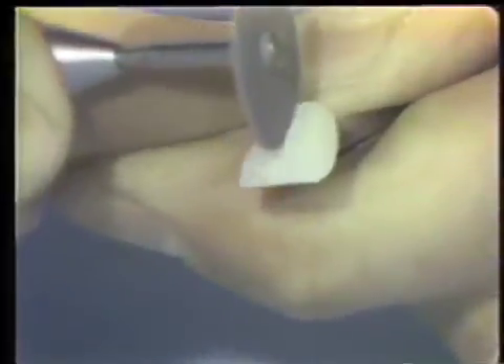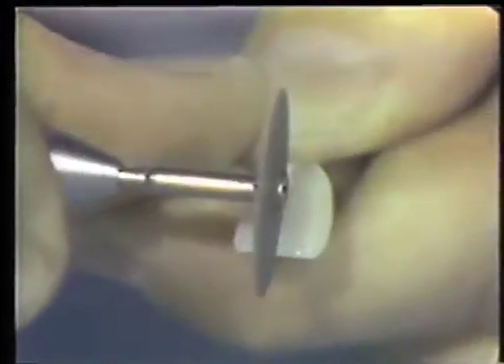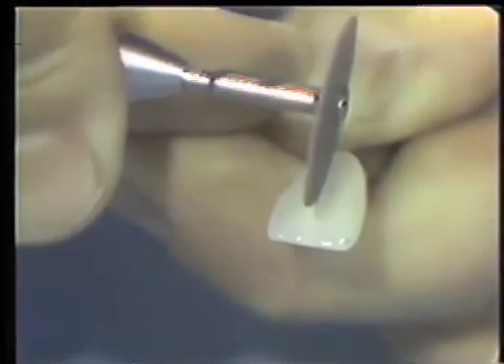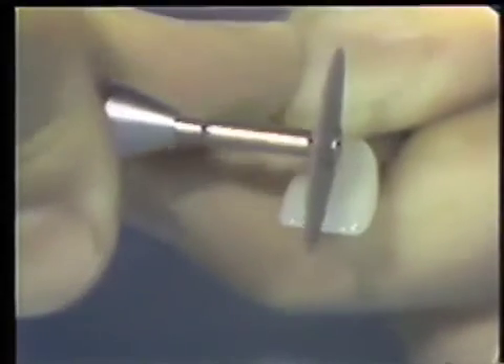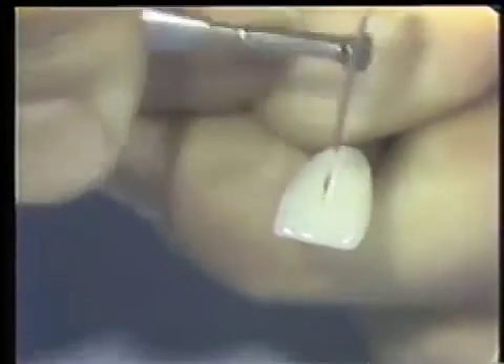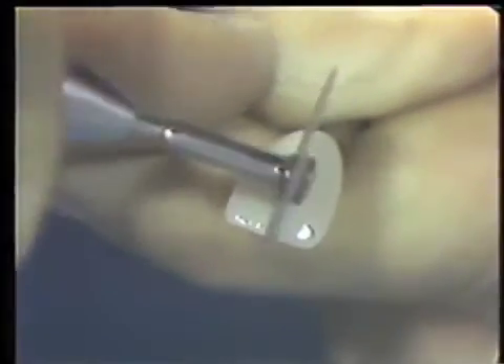We had exposed the metal. We're going to take a screwdriver and twist it, and the portion is going to crack, but it should not separate from the metal. Now we're down through to the opaque, and getting it a little bit deeper here on the incisal.